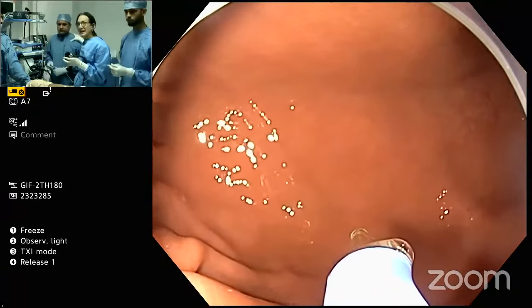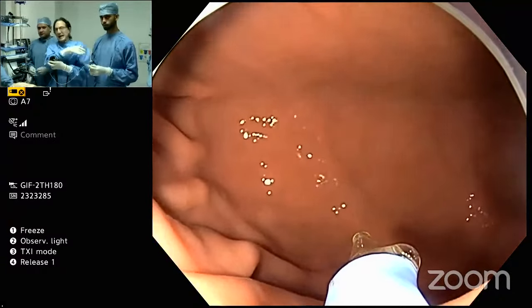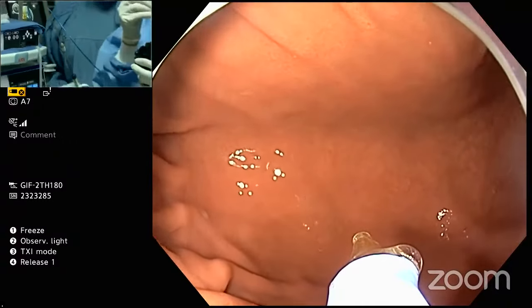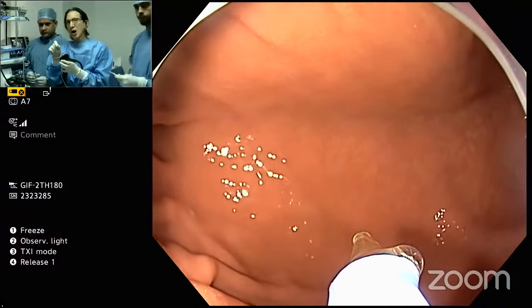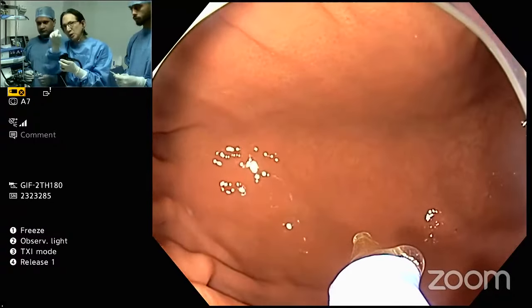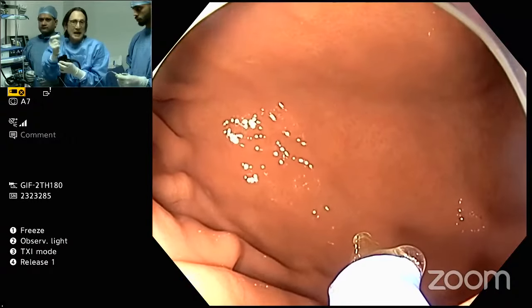So Ashwani is with me on my right, just like yesterday. And today I have Assis on my left side. I've got a double channel scope. He's not going to do anything right now. But Ashwani, you can see that if you pull the sheath back, what it does is it opens up the loop, and the loop is mounted on a snare. And that's what gives the loop stiffness. There are little lugs on there that I created that mount the loop on the snare. Now the loop will snap off of the snare afterwards, but the snare is very stiff.